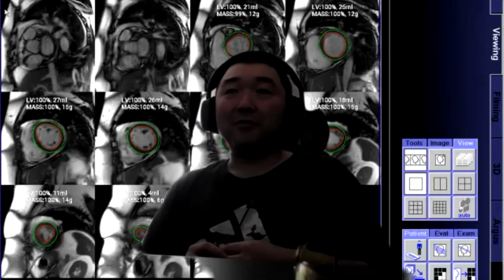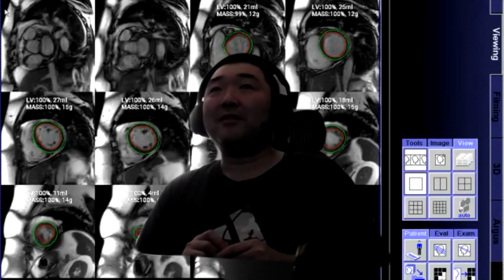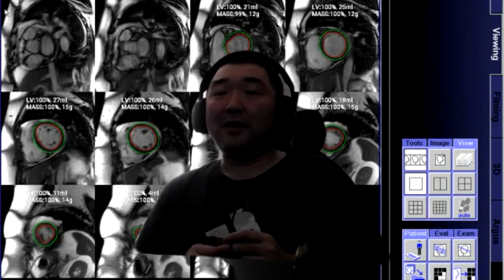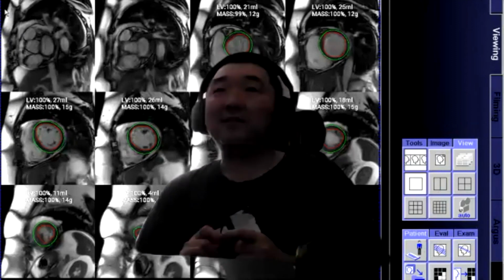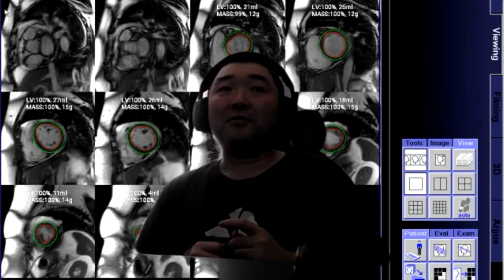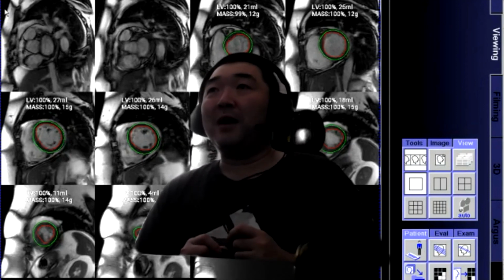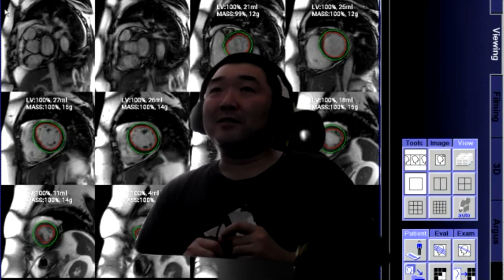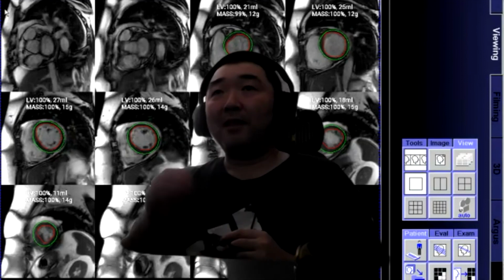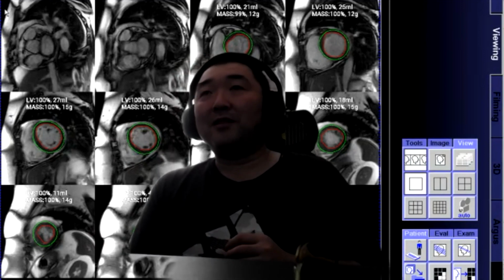You can do both. So normally I upsample the image to a fixed resolution, for example, 1 millimeter squared, then fit to the model. It's also possible if your model has a full convolution architecture, it's maybe handle a variable image size. But it's also subject to the training. So if the training, including the data augmentation, is robust to the object size changes, then yes, you can input different size into the models. But most common way I'm doing is to firstly upsample the image, then give it a fixed size.